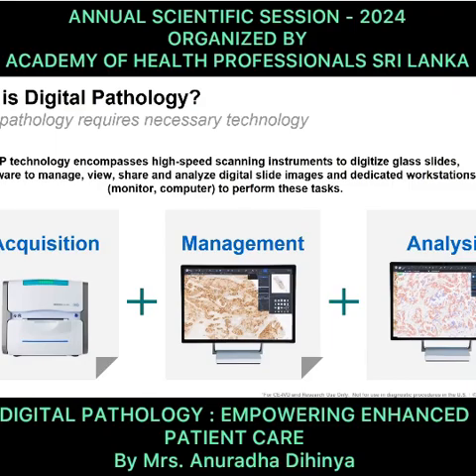When I'm talking about the dedicated workstation, those are the medical grade display monitors, where this task is performed by the histotechnicians also, because histotechnicians play a very important role over here. Then the pathologist does the diagnosis, and the IT administrator also plays a major role. Why am I talking about the IT administrator?